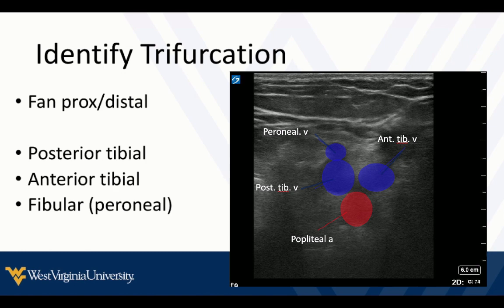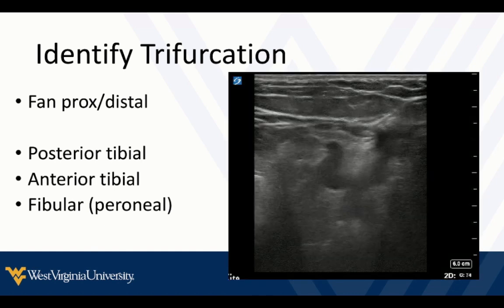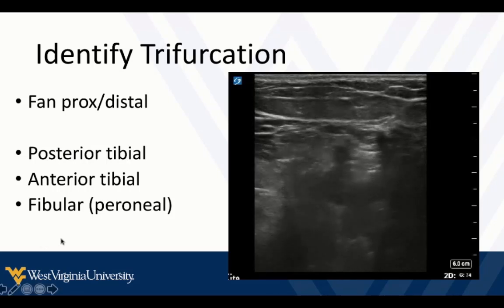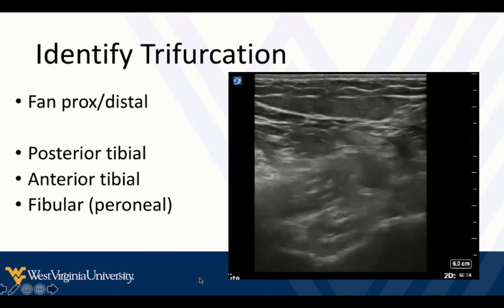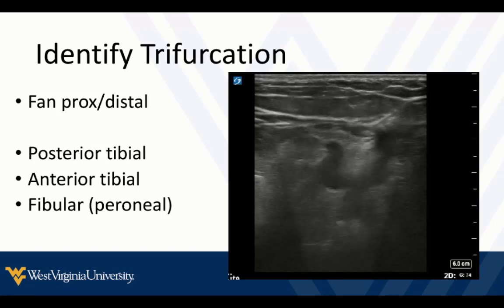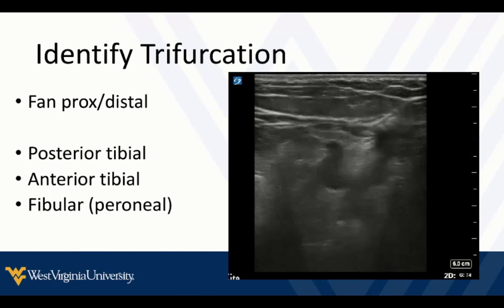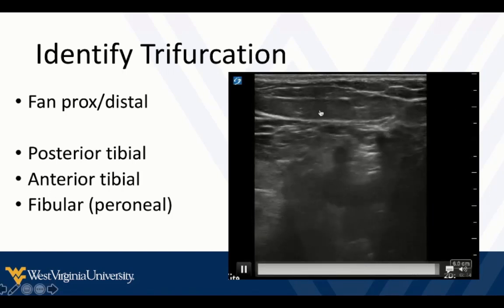After that, we want to fan proximal and distal. In most patients, the trifurcation is actually proximal to the popliteal crease, but it differs from patient to patient, so just fan proximal and distal keeping some compression so you can identify it. Look for the trifurcation — you don't need to name each vein, just try to find all the branches from the popliteal vein and make sure they collapse. These junctions are places where clots like to get hung up, so make sure you examine them. They're all nearby next to the artery, and as we compress we see the bone of the distal femur edge into our screen. At about six centimeters deep — depending on your patient, this may be more like eight centimeters — these are deep structures and should not be sitting up in the subcutaneous tissue. You should be seeing connective tissue and muscle tissue around these deep veins and the deep artery.